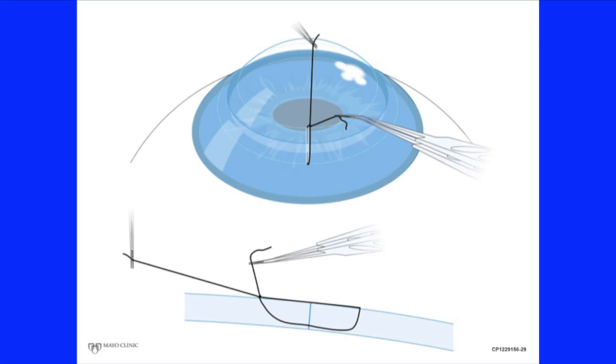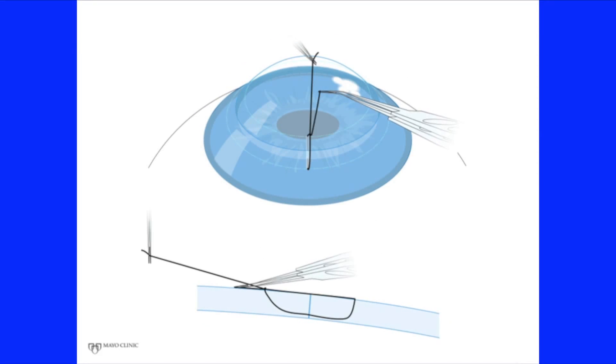Then pull hard on both the long and the short suture to lock the first throw into place so it cannot tighten or loosen. Then lay the short suture on the corneal surface.